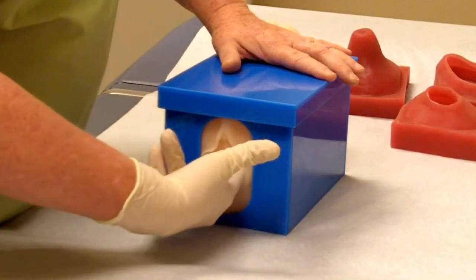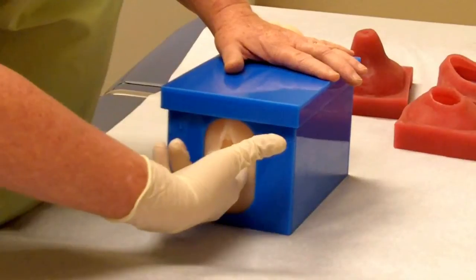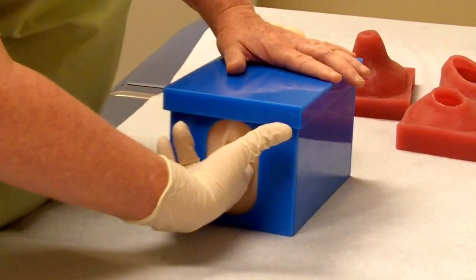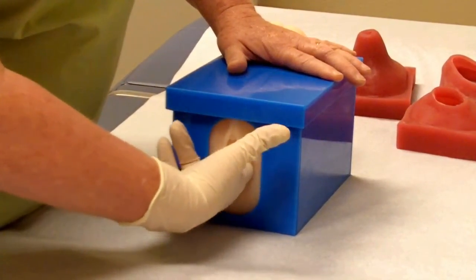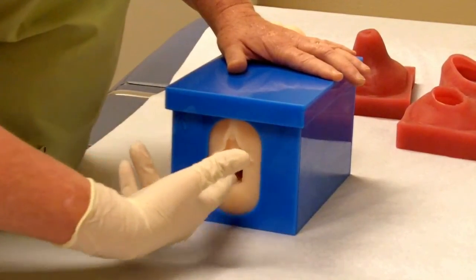This is a good teaching tool because the student would not know what is inside the box and how it has been set up. The student would then tell me that she felt that this particular cervix is 3 centimeters dilated and 80% effaced.